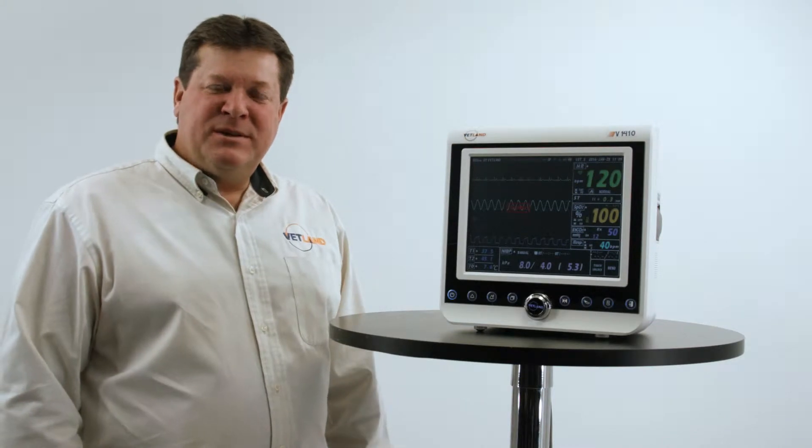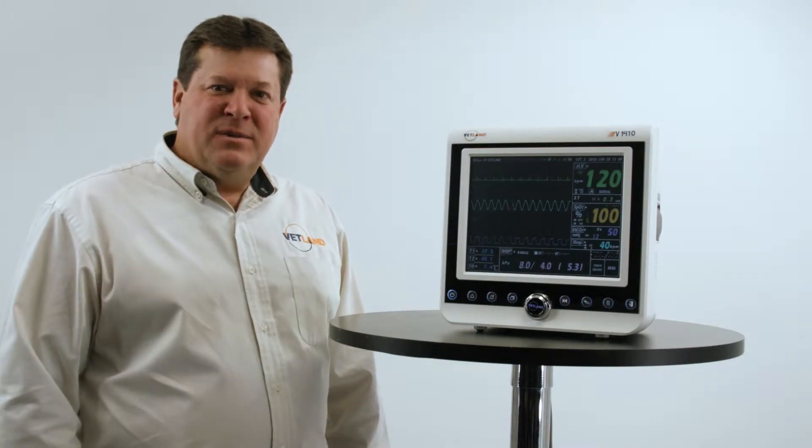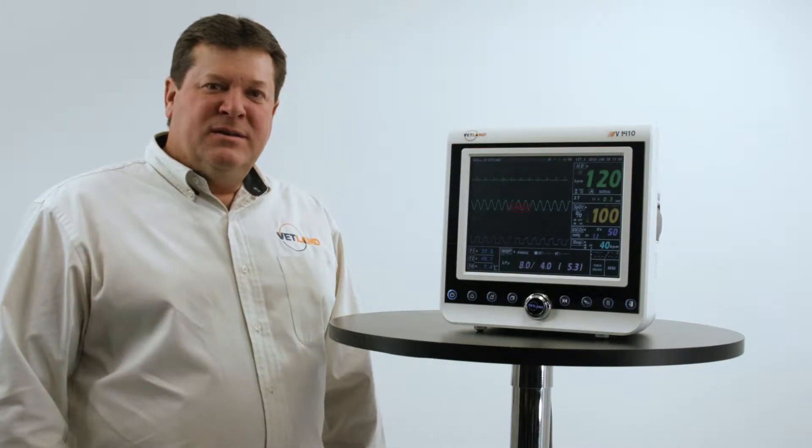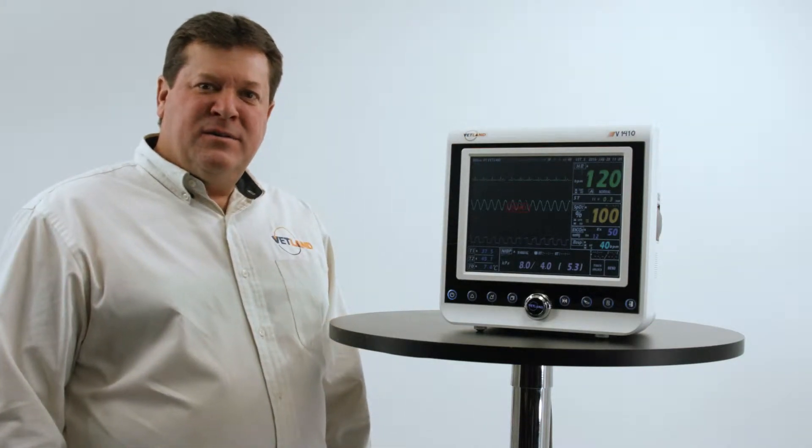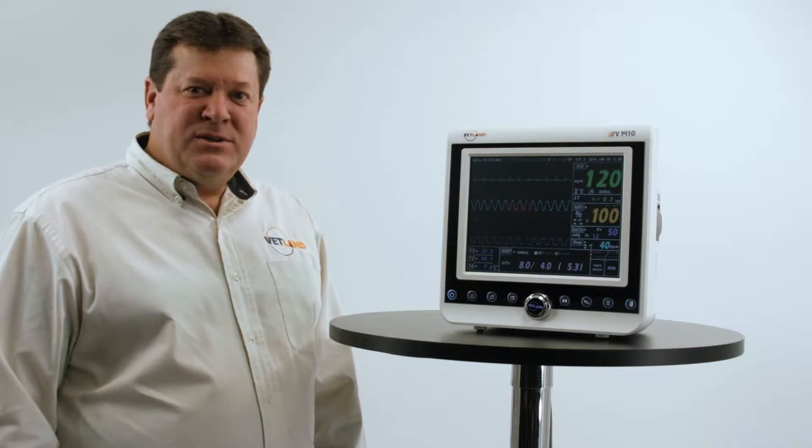Hi, I'm Brad Rump, president and owner of Vetland Medical. In this video, we're going to discuss our line of patient monitors.